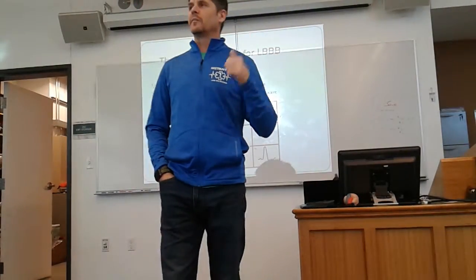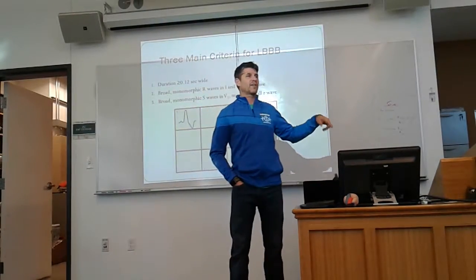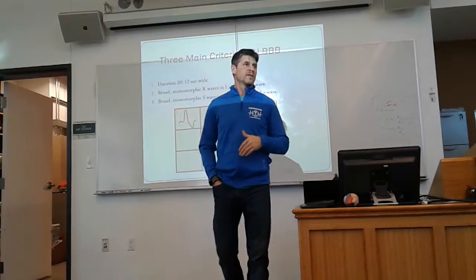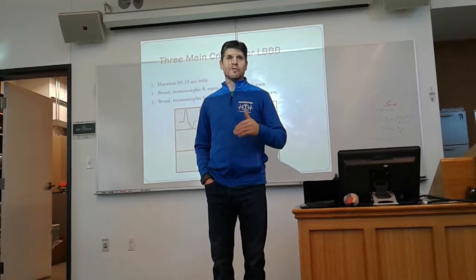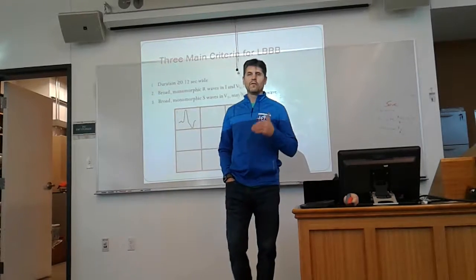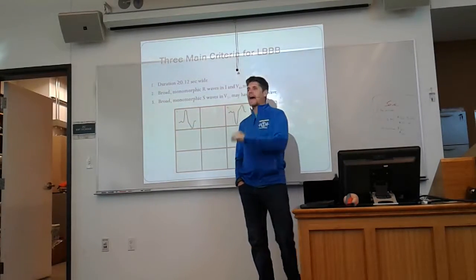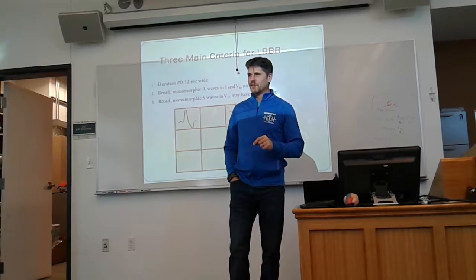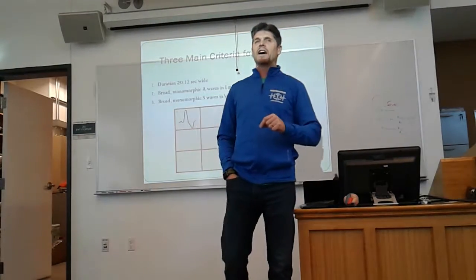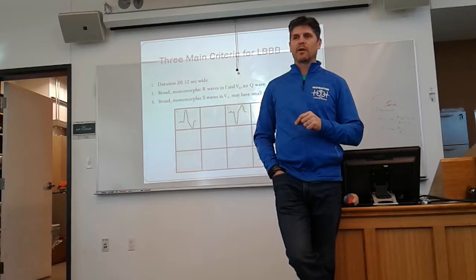If they've got sympathetic nervous system activation at the same time, so you've got a tachycardia, you might be calling this VTAC, when in fact it is absolutely not. Does that make sense? So left bundle branch blocks can make our analysis a little bit more difficult, and because of that, it might make our treatment scheme a little bit more difficult to come up with.